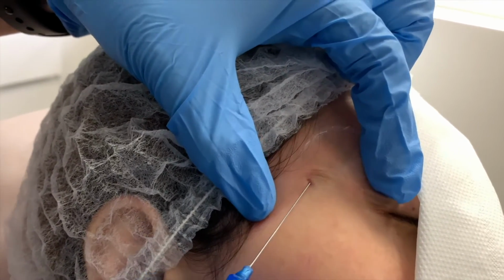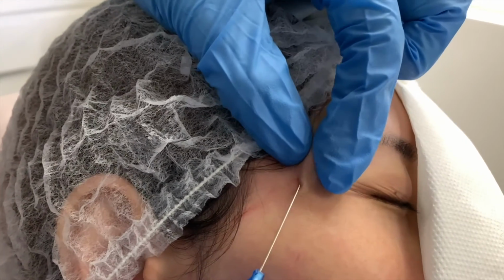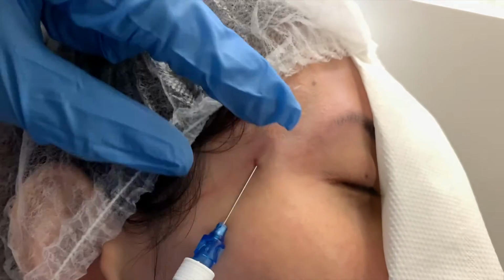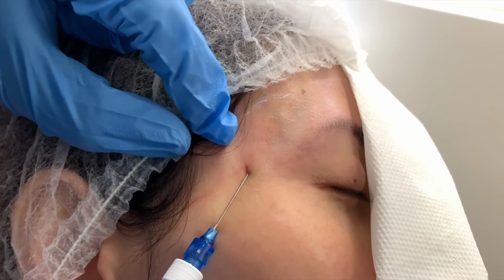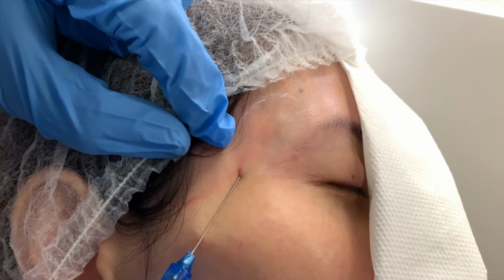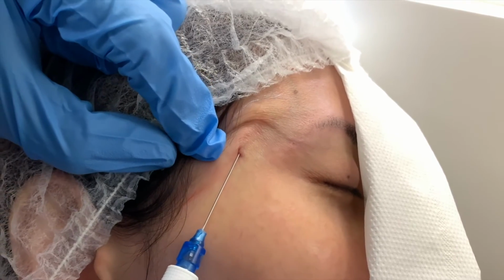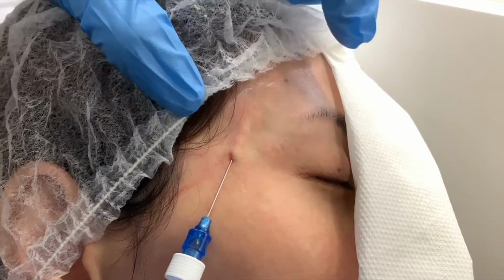A needle is usually not used because of superficial temporal veins. A needle can cause puncture to the veins, causing massive bruise. And if the needle inadvertently goes more superficial, it can also injure the artery in its path. A cannula can of course hit the artery, but the risk is a lot lower.